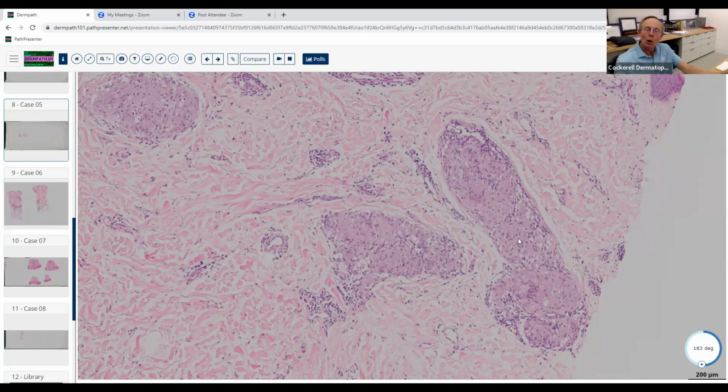Which of the two poles would this be migrating toward? Tuberculoid. Yeah, tuberculoid. And it's sort of backwards in your brain a little bit because you say, well, this doesn't look like tuberculosis, it looks like sarcoid. But the tuberculoid form of Hansen's looks like sarcoid.